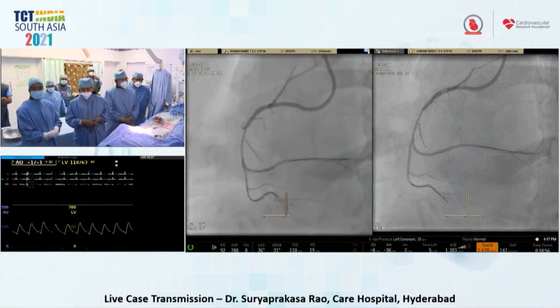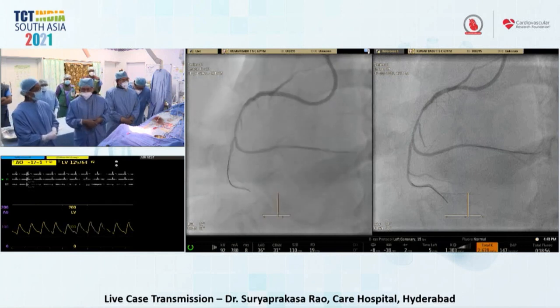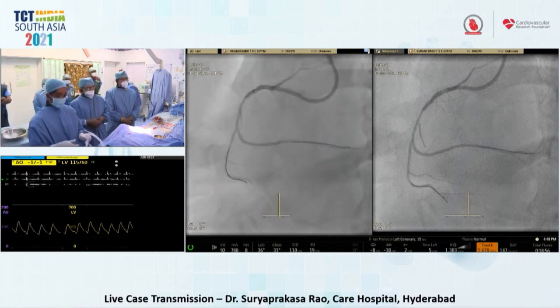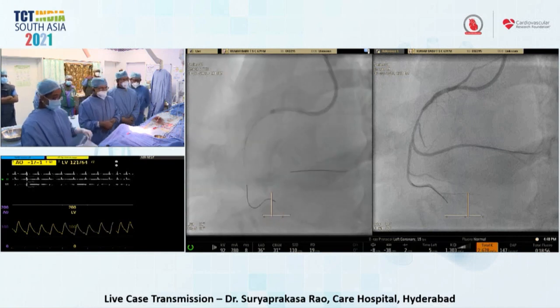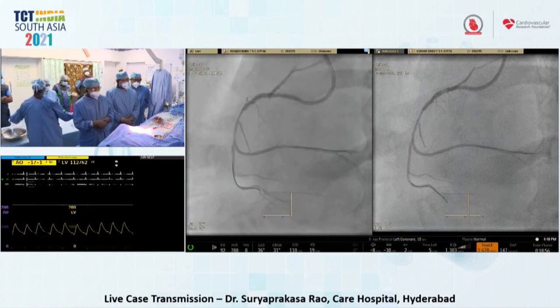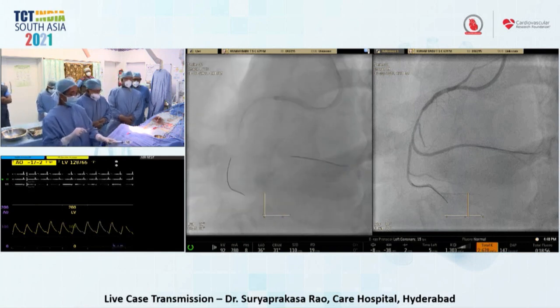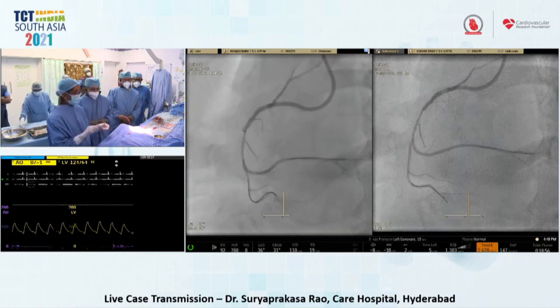Just a question to you from me, Dr. Ferenc from Germany. I think your result after pre-dilatation looks really nice. I didn't see really huge dissected segments in the IVUS. So did you think about the option to treat these patients with drug-coated balloons, just not to stent? Or would you definitely go with CTO PCI?